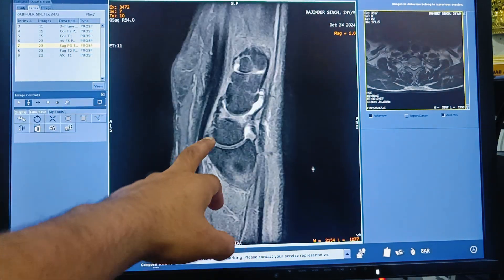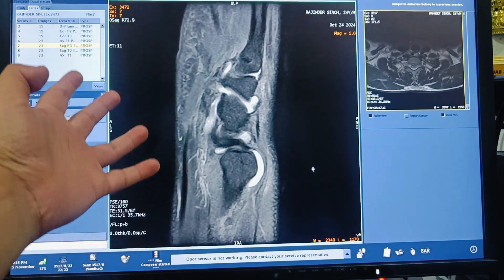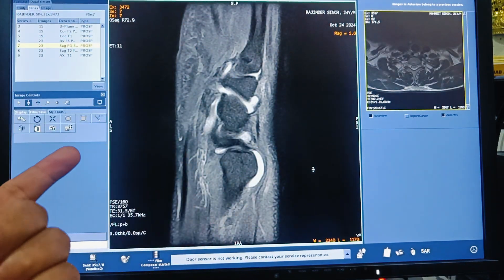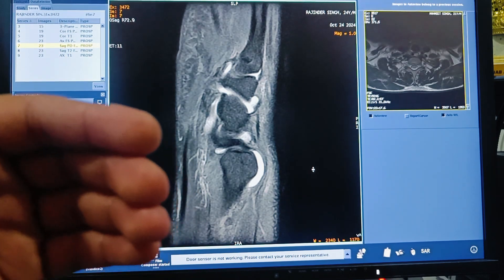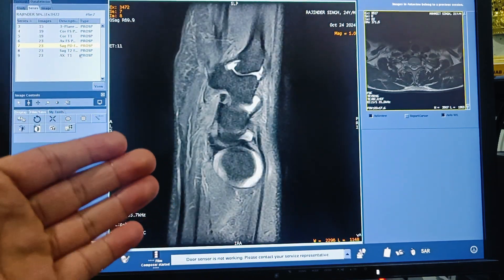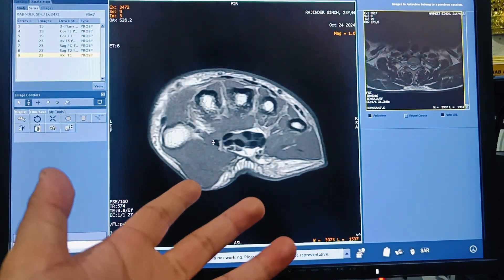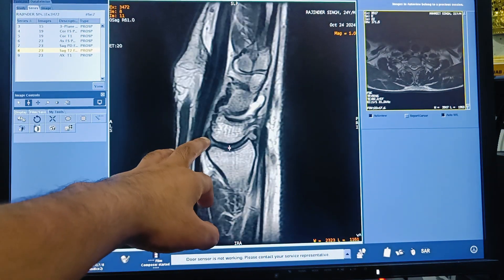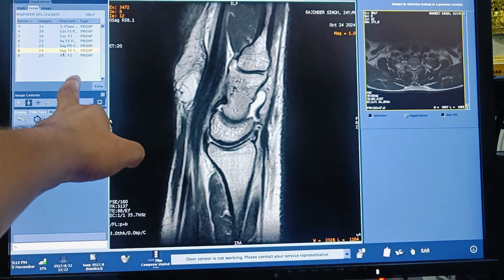You also need to acquire PD fat suppression on all three planes: sagittal, coronal, and axial. Additional sequences such as T2 and T1 depend upon the radiologist's request. I also acquired a sagittal T2 weighted sequence as part of this study.